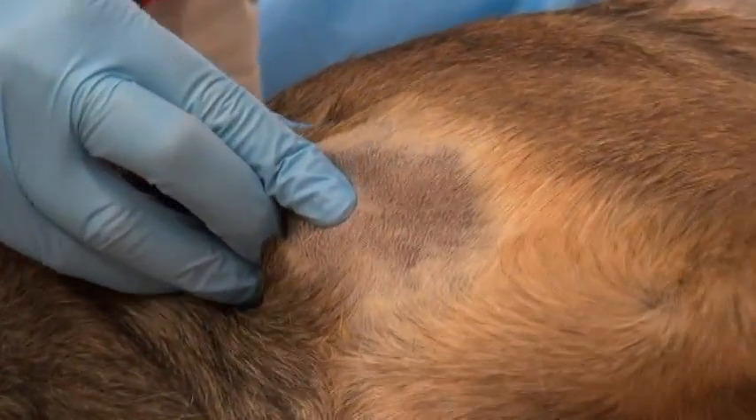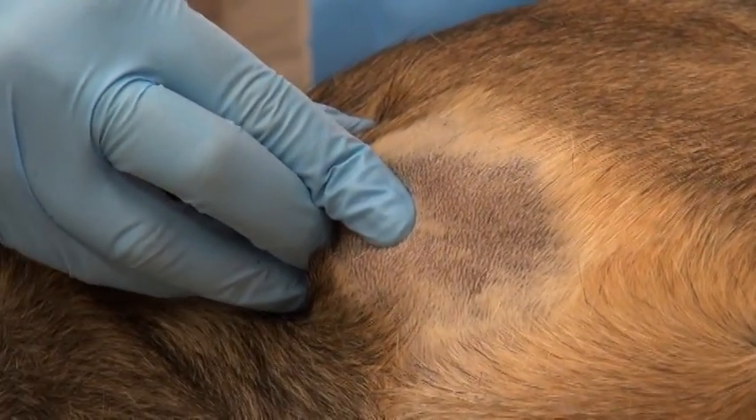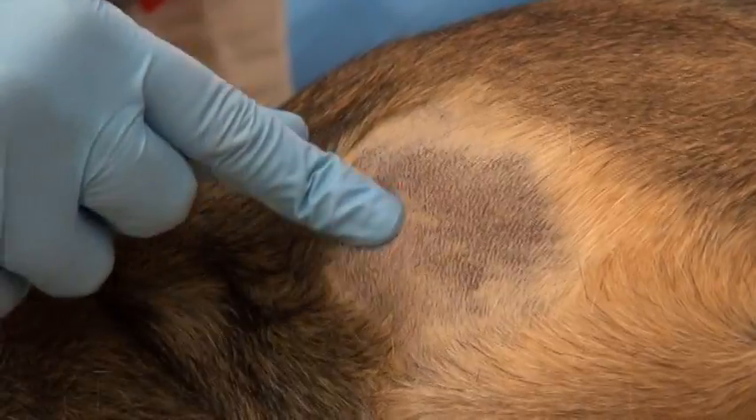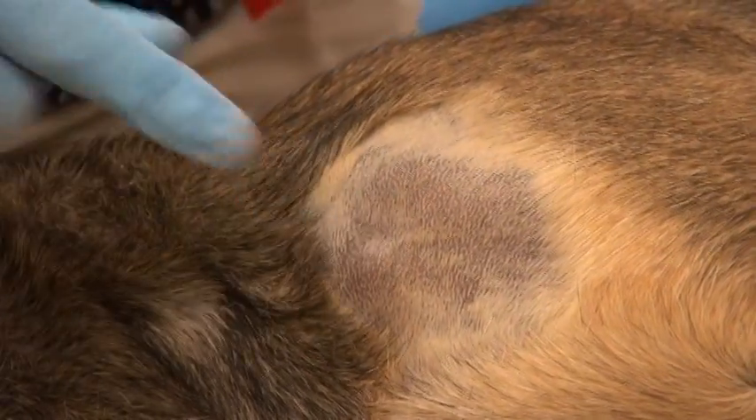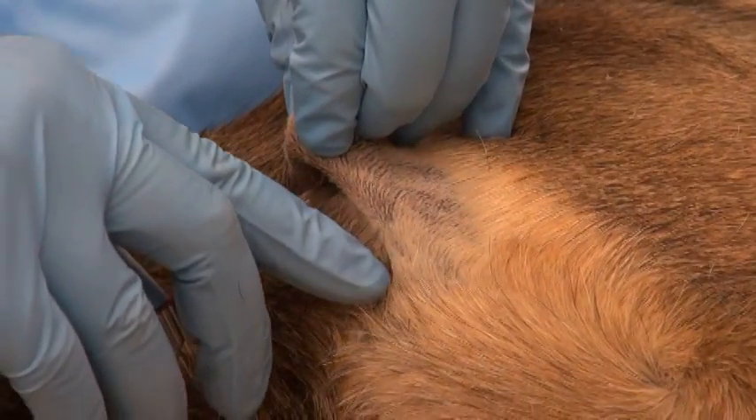The bone is palpated and a decision is made about whether the needle can go perpendicular to the bone in a large dog like this, or if it needs to be aimed more down the long axis of the shaft of the bone in a smaller bone.